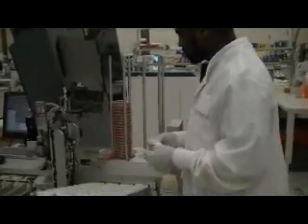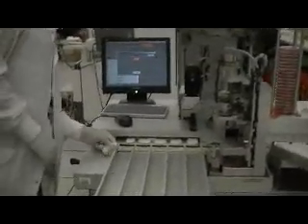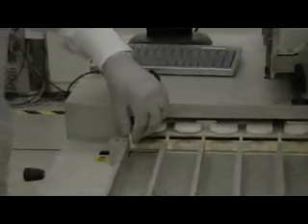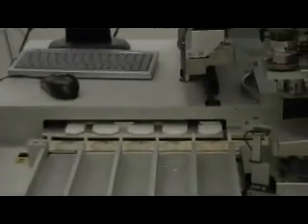With a number of sensors. As you can see here, there's a sensor over here. It's there to sense when the belt is running, to see if the belt is in line. This makes sure that the urine is in the right position when the belt is moving. So you have to make sure that the sensor is cleaned, and there's also a sensor here and another sensor over here. Then we have some sensors that are inside here that need to be cleaned too.